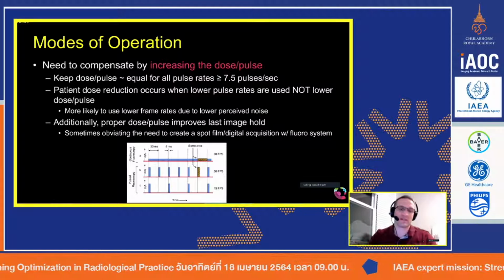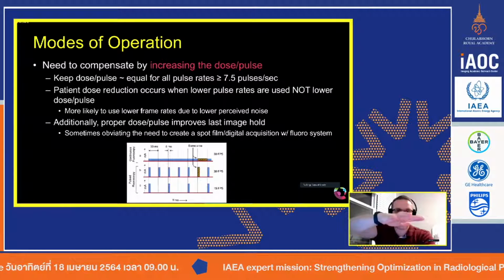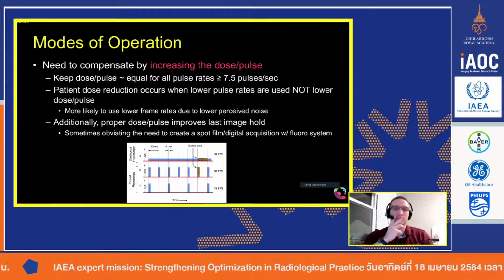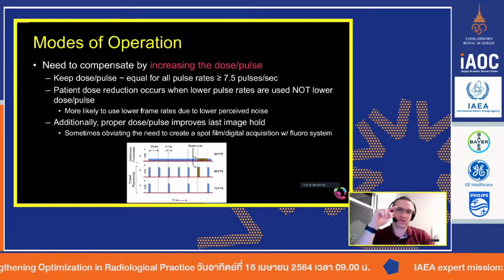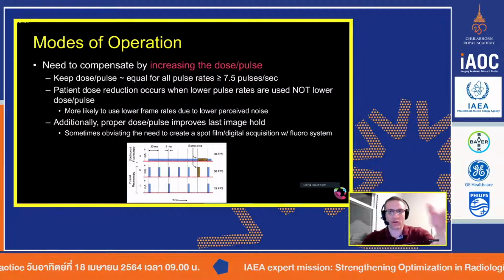Well, that relies on the fact that you have a couple of different tools to work with, one of which is a last image hold. So you let off that pedal, and the last image that you just acquired would be presented there in the room. And so you could look at the image as a physician, and you can decide if you want to do this or that, or change your trajectory, or hey, maybe we need to manipulate the patient. You use that as a way to think forward, think on your next step.